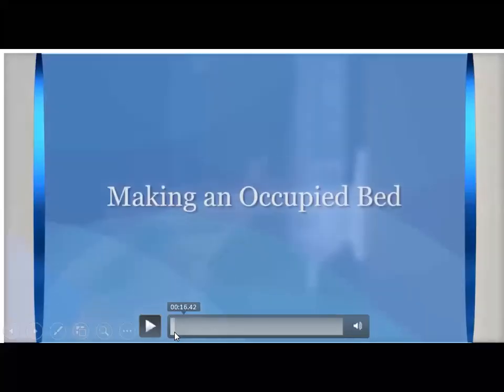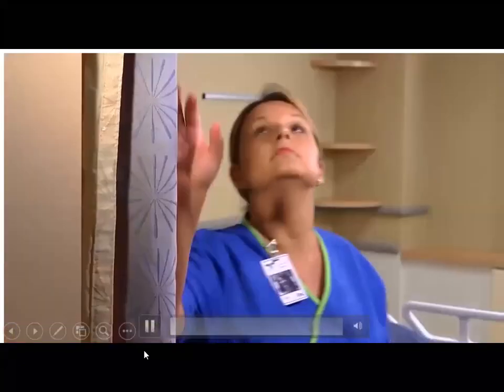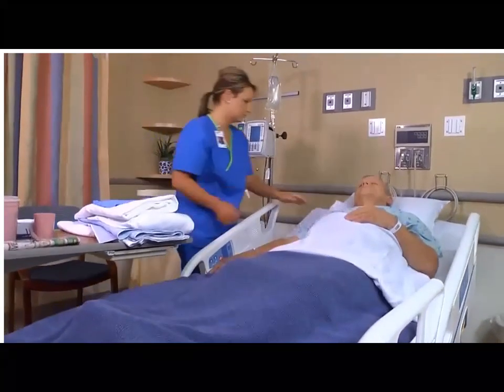Explain that might affect patient positioning. The patient's safety and comfort are of the utmost importance. Ensure patient privacy and introduce yourself to the patient.